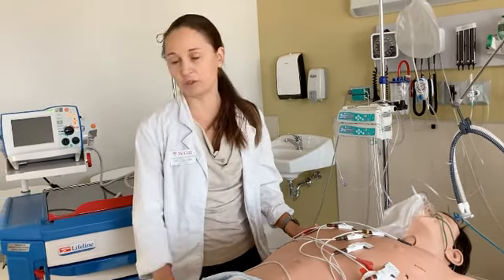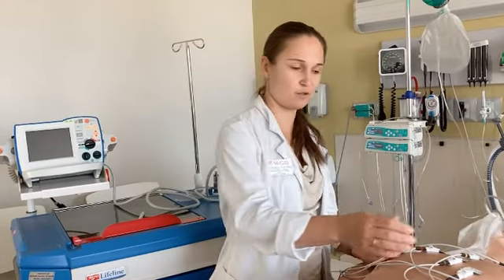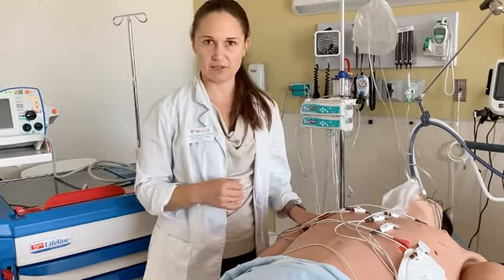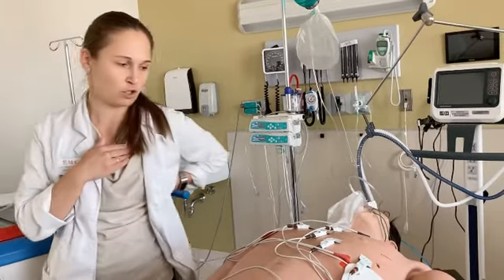To pace, I will use my defibrillator and I will use the pads. We can't really pace a patient with paddles, because you need to be able to step away from the patient. The pads are applied right now in the defibrillation and monitoring position. You can pace the patient like this, but this is not an ideal placement for the pads. To have the most success in pacing, we should apply pads anteriorly and posteriorly, like this, to capture most of the myocardium with pacing.